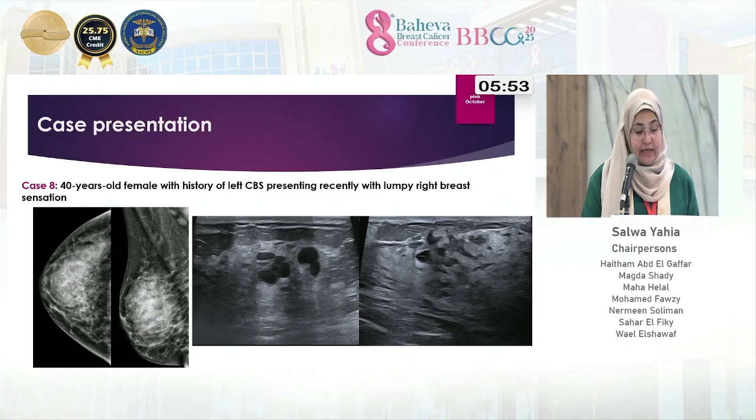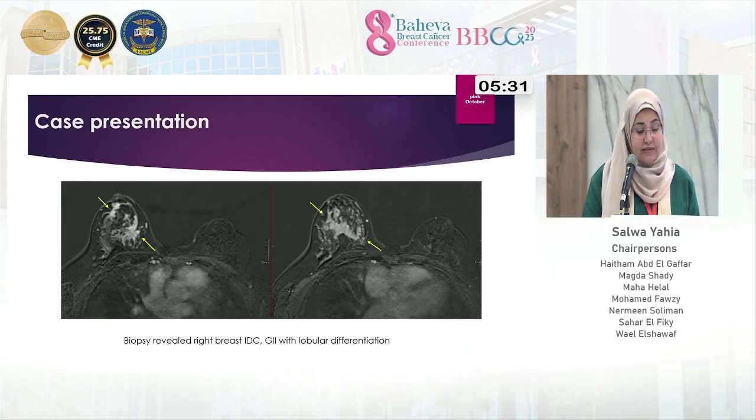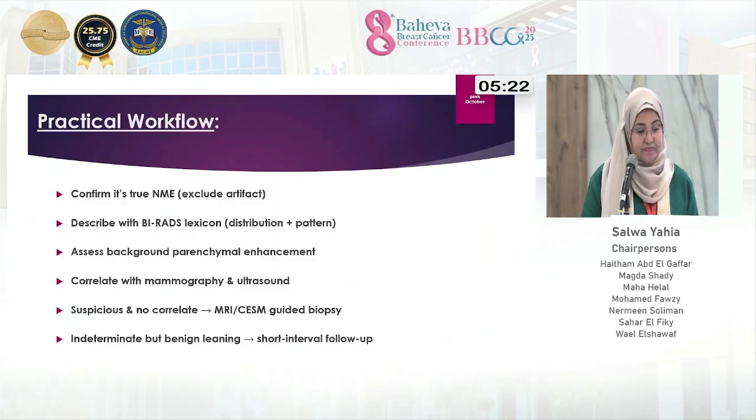40 years old female with history of left breast conservative breast surgery, presenting recently with lumpy right breast sensation. Digital mammogram of the right breast in CC and MLO view showing dense breast parenchyma, ACR C, and ultrasound showing multiple parenchymal areas of altered parenchyma. So MRI was done, revealing multiple right breast regional areas of heterogeneous non-mass enhancement. Pathology revealed invasive duct carcinoma grade 2 with lobular differentiation.